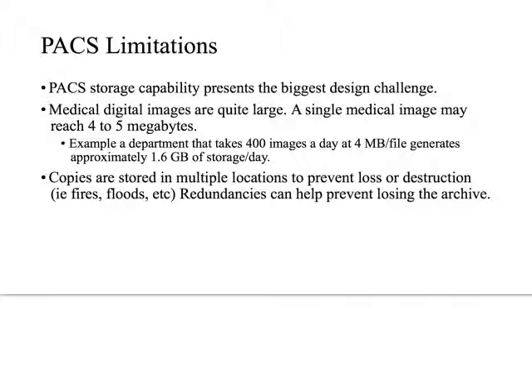So there are some limitations, and the biggest limitation is storage capability as well as compression. So these images are huge. Like a single medical image may be 4 to 5 megabytes, just that one image. I mean, that's massive. So an example that takes 400 images per day at 4 megabytes per file generates approximately 1.6 gigabytes of storage every single day.